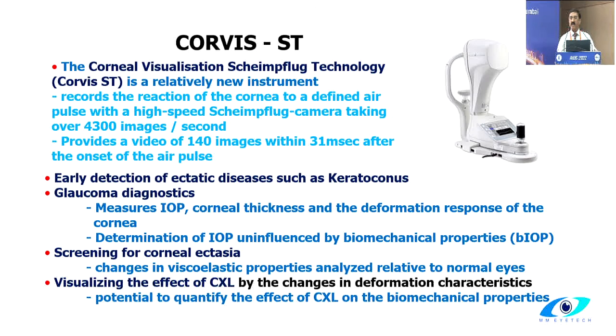This is the newest device. The Aura, as it existed, is now no longer in the market. They have gone off into glaucoma as their main area, and they're not doing as much of refractive work anymore.